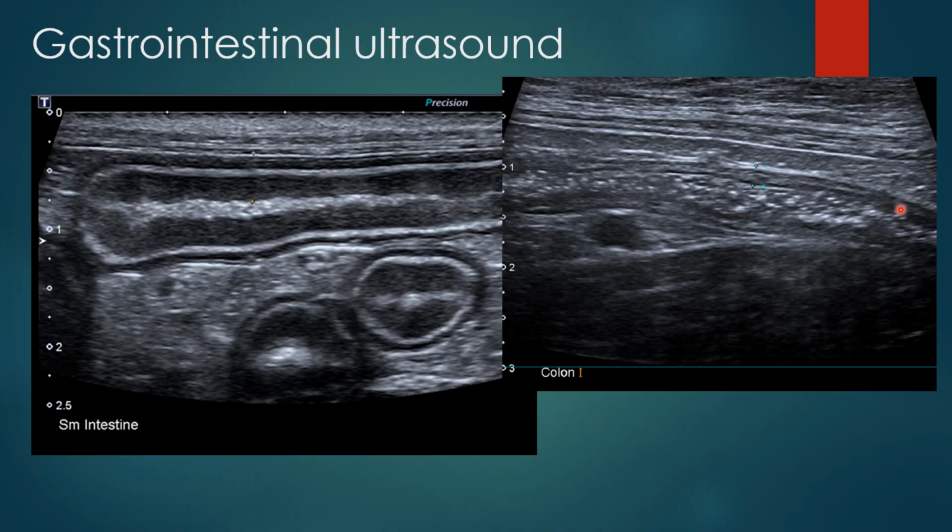Okay, so this is another sagittal view of the colon. So here's the kind of ventral wall, here's the lumen, and then the dorsal wall is here. And in this image, we have a sagittal view of the jejunum. So the wall is thicker, same layering pattern though, alternating from hypo to hyper to hypo. And then the lumen, another wall here. And then these are just segments of jejunum in transverse. Okay, so if I was to image this one cut through here in a transverse plane, it would look like this. They look like little hamburgers or macaroons.